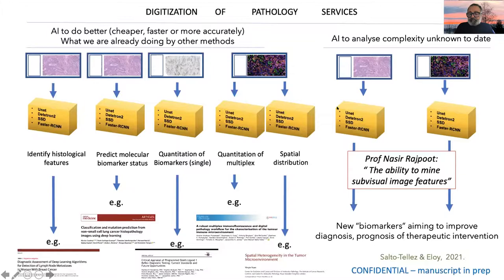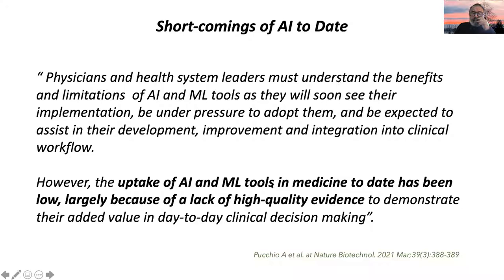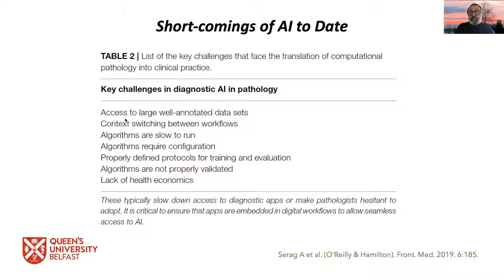This doesn't come without shortcomings. Remember, the uptake of machine learning tools so far, not only in pathology, in other areas as well, has been low, probably because we still lack high quality evidence. In fact, when Paul O'Reilly and Peter Hamilton looked at this, they highlighted all the key challenges that we have today in the way we structure our studies, we develop our algorithms, the healthcare economics that are falling behind.